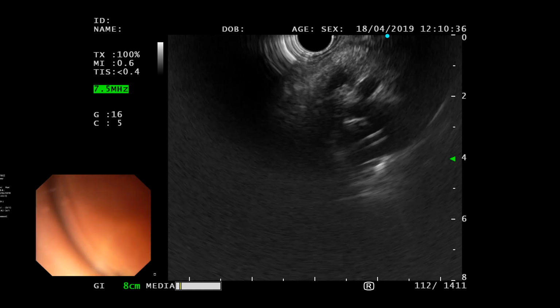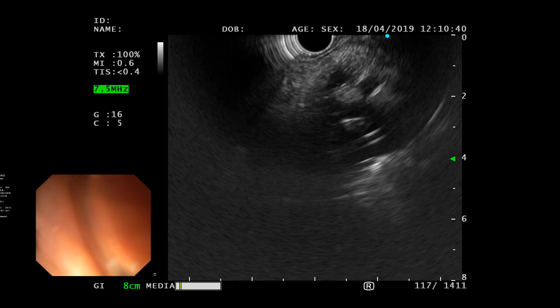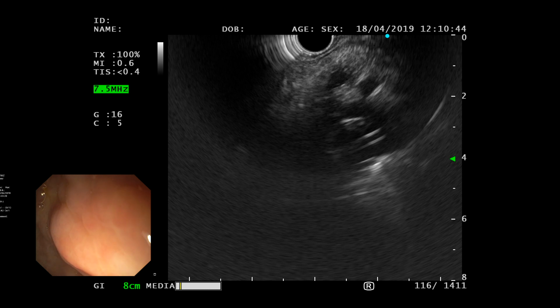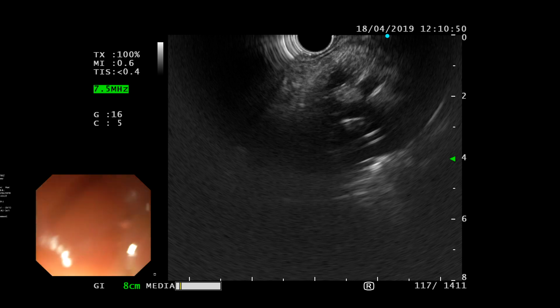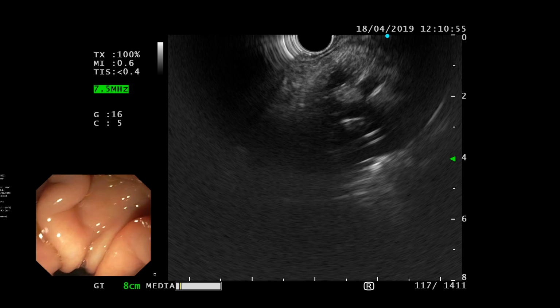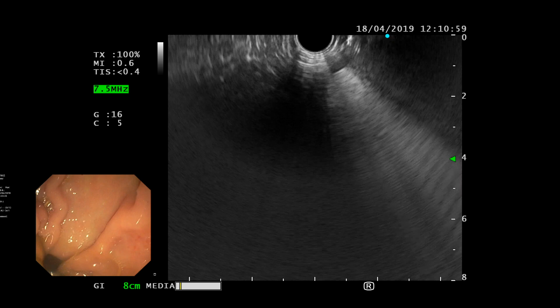This is your bile duct because that's the stent in the bile duct. There's the pancreatic duct. So the pancreatic duct comes down around like this and goes down, and then this is the very dilated CBD with the pancreatic stent, because she's obstructed lower down. Okay? So now we're going to go into the bulb and see what we can see.